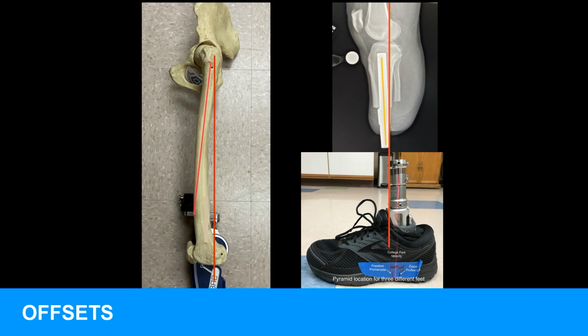If you look real closely, it's probably a bad picture, but that blue tape down there, I actually put 3 different feet in. I put a Freedom Promenade foot. This is a Velocity foot that's in there now, and there's a ProFlex LP. And I marked the different starting points for the pyramids. So every time you change feet, you may need a different offset because the pyramid starting point on the feet is different.